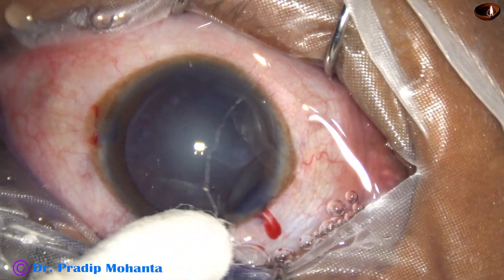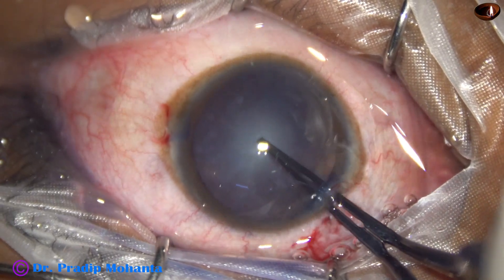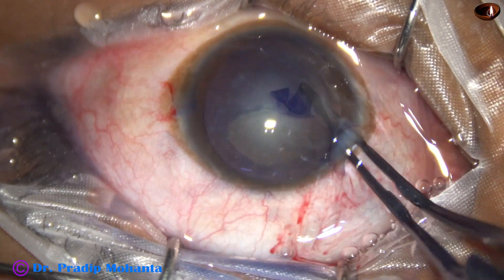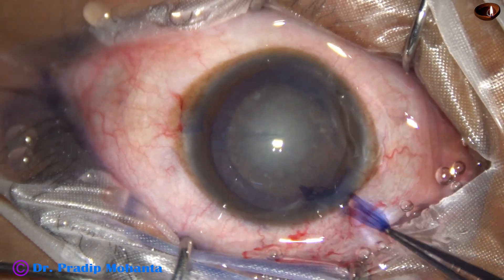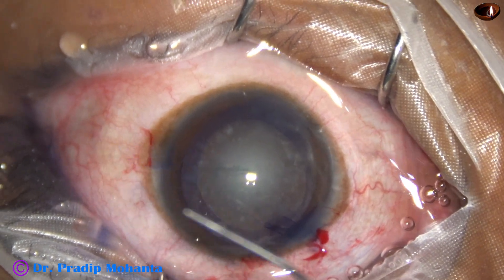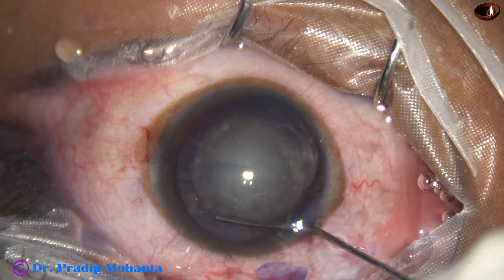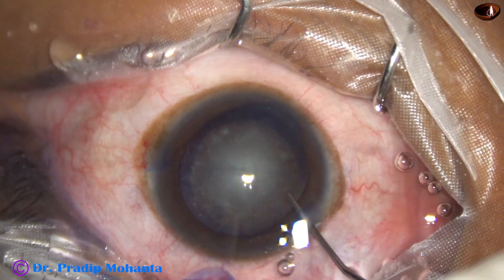Now capsulorhexis — a utrata forceps is being used for capsulorhexis, and it is done. The size of this rhexis is about 5.5 millimeters. Now hydrodissection is done with a 27-gauge cannula. Everything is fine till now.